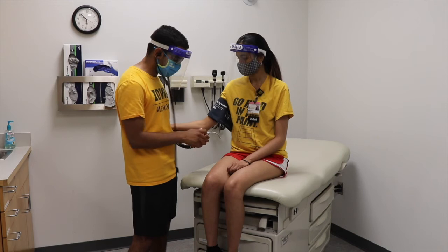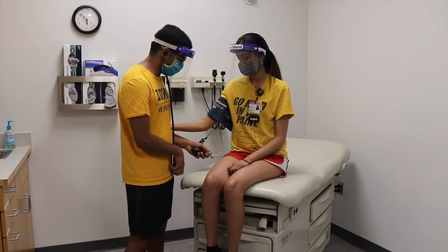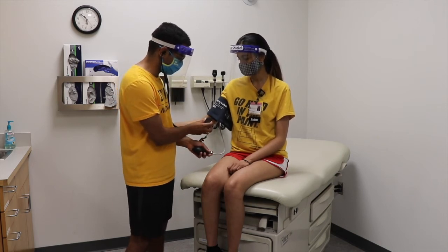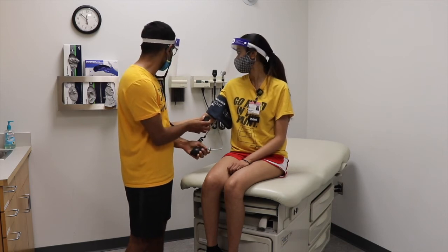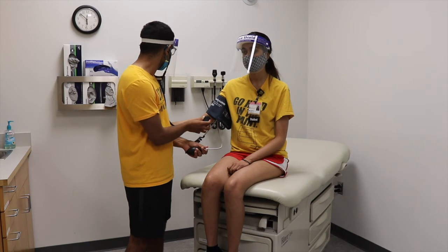So then you want to tighten this valve right here, and then place the stethoscope on the brachial pulse, and start inflating the cuff until it gets to 200. Once it's at 200, start releasing and try to listen for the systolic.